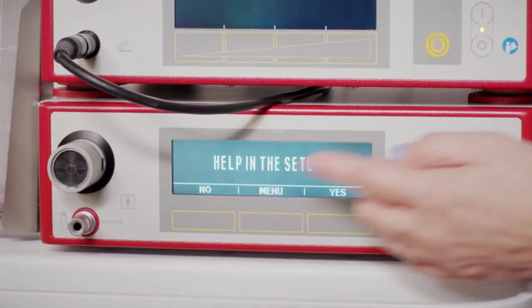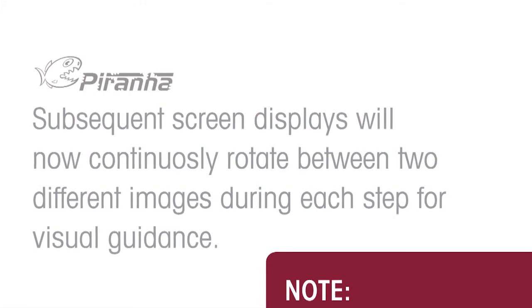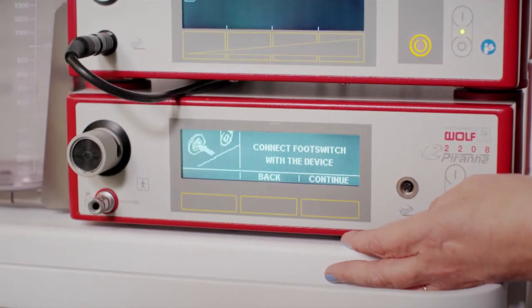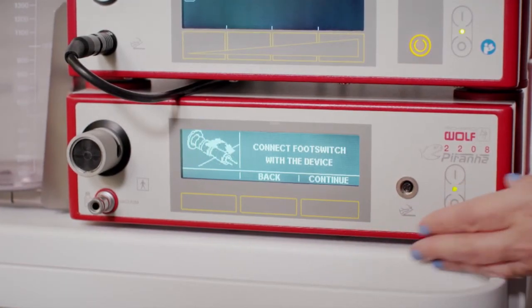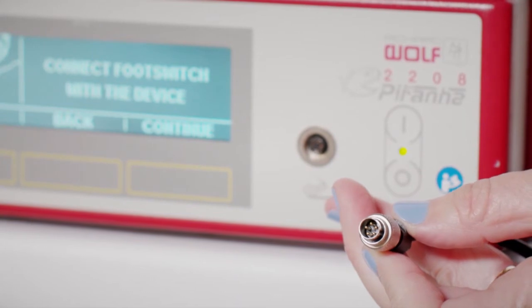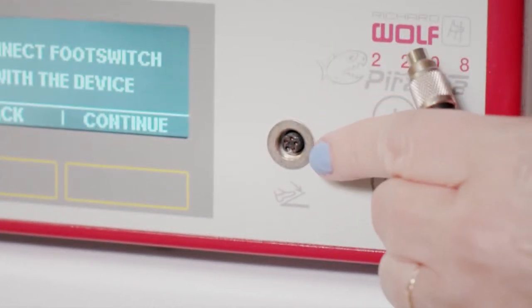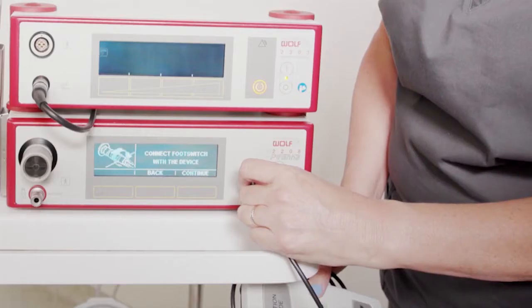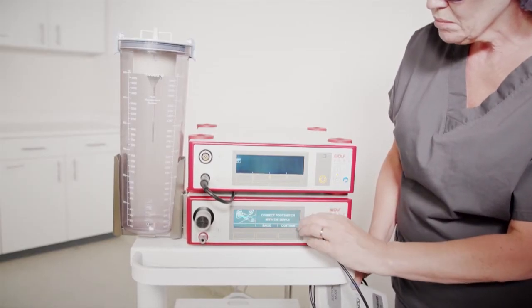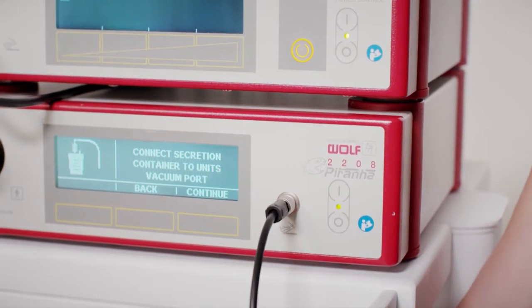Begin to follow the instructions on the suction pump screen. The screen indicates help in the setup — select yes. The screen then indicates connect footswitch with the device. Connect the footswitch to the suction pump unit by lining up the pin on the footswitch cord with the groove on the footswitch port. Push the metal end straight into the footswitch port and turn the outer ring clockwise. When assembly of the footswitch is complete, press the button under continue.